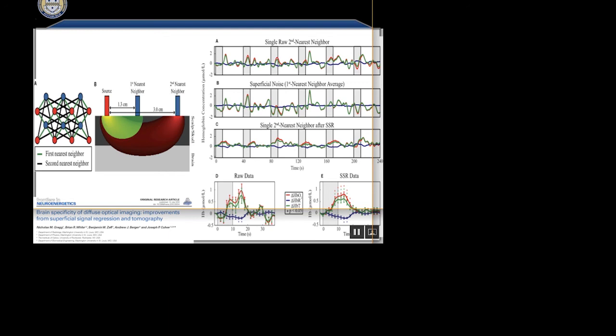So I plug one of these detectors into this connection. These guys are making their own systems, so I'm being a little careful about what I show. We're not in the business of showing prototype things, especially. But in reality, you can see the light changing in those tiny little probes. The other two are just mechanical, just to keep it stable.